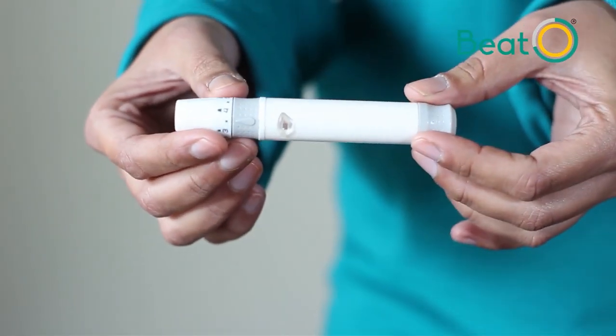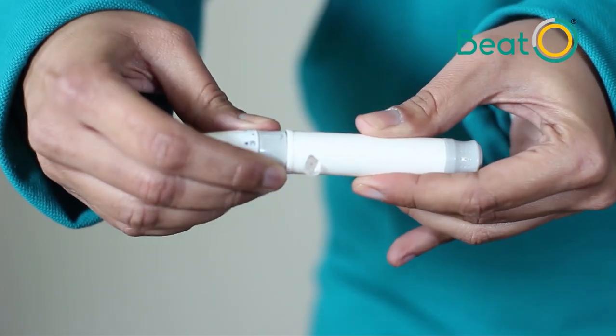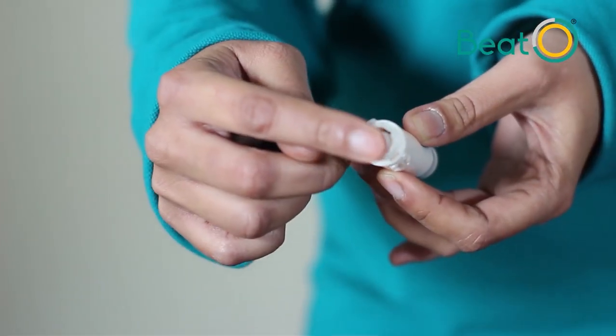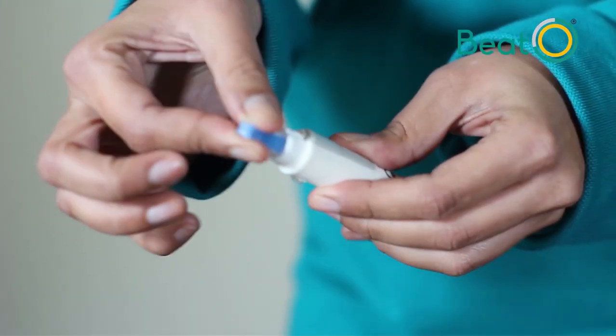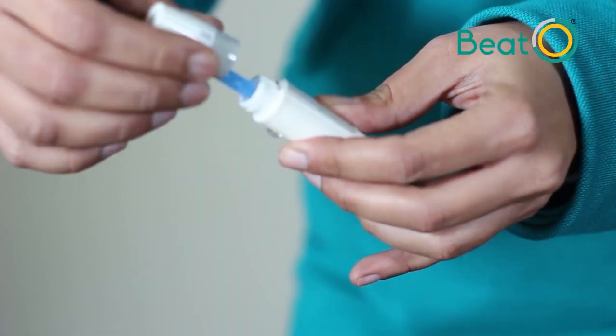Before taking your blood sample, prepare your lancing device. Twist it open from here — this is where you will put your lancet. Take the lancet, twist open the protective disc, plug it into the lancing device, and close it.